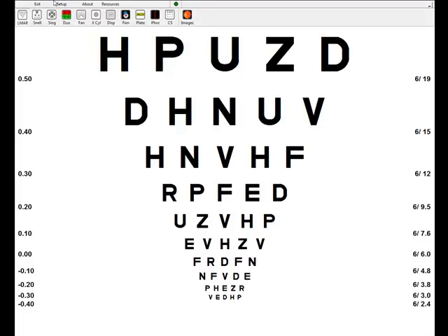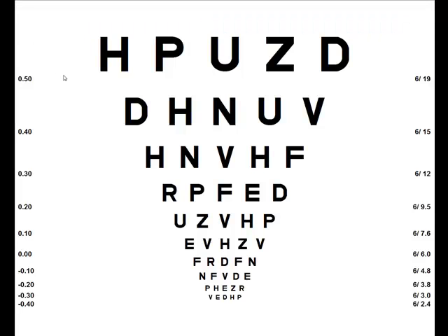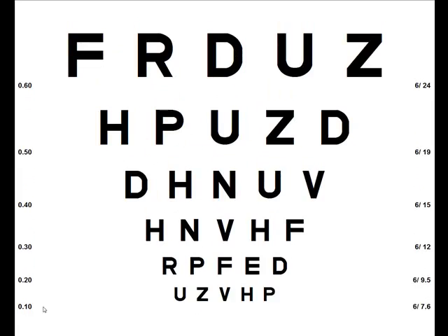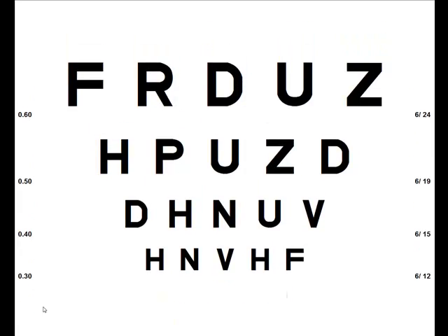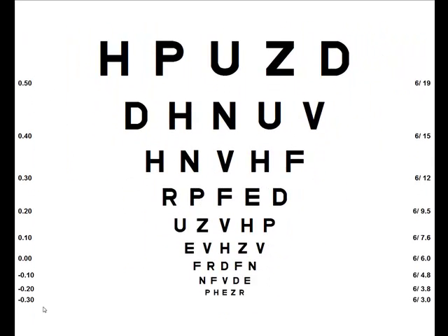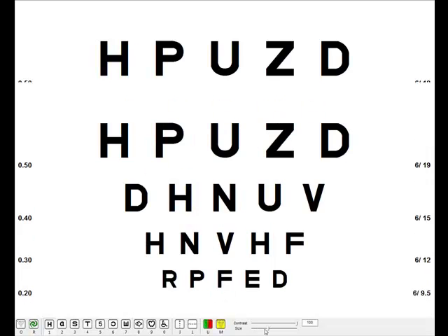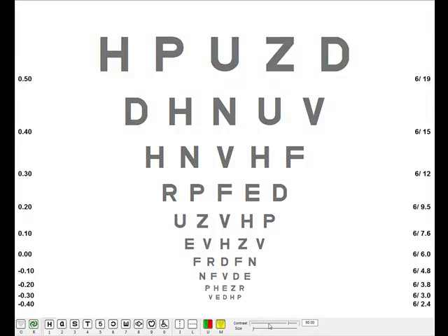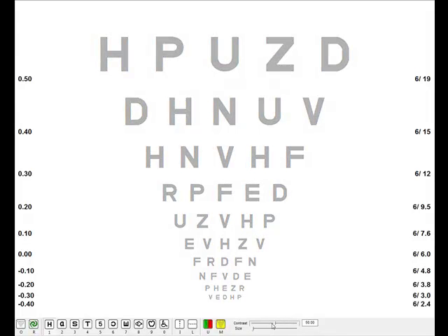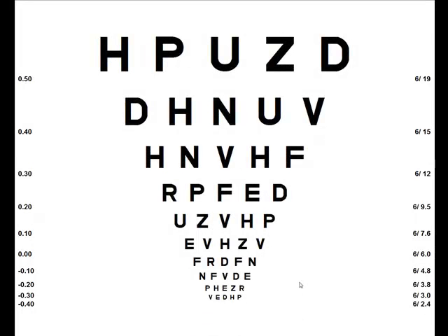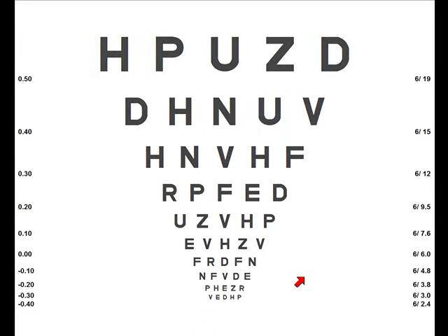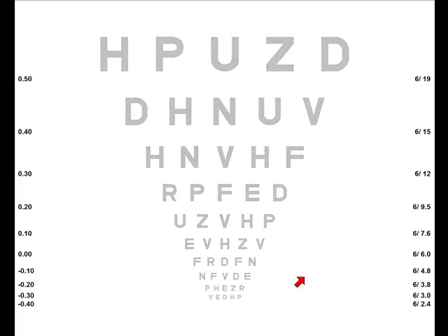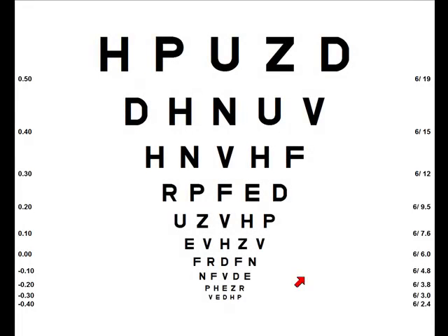We're currently in logMAR mode at the moment and you'll see that the letter size goes all the way down to logMAR minus 0.4. Not many patients will be able to see that but at least it allows you to measure a threshold even with your patients with the best visual acuity. You can change the size of the letters by simply using the up-down cursor keys on the keyboard or the scroll bar at the bottom of the screen. You can also vary the contrast of the chart by using the scroll bar here or using page up and page down on the keyboard, and there are approximately 250 different contrast levels.